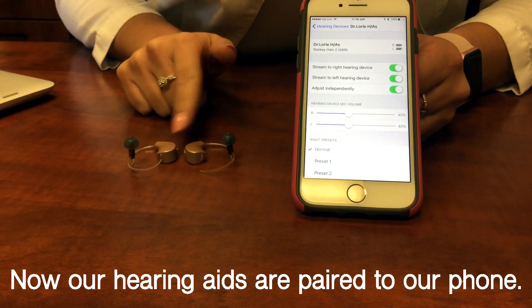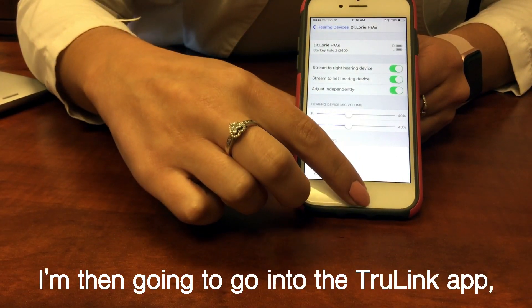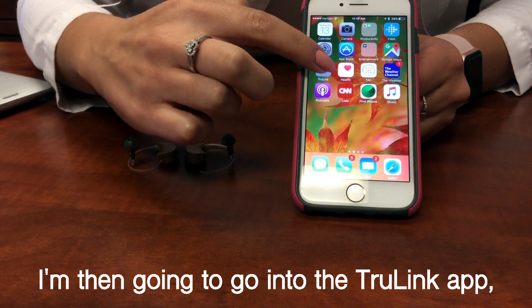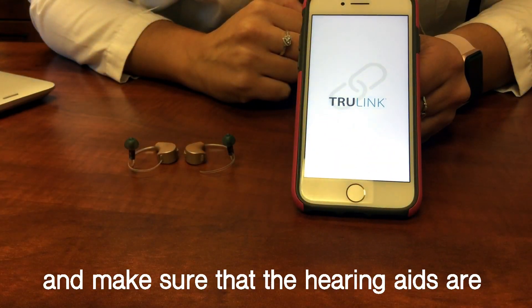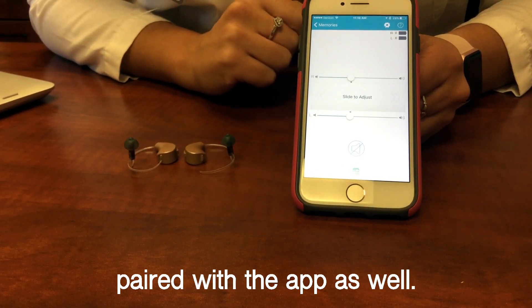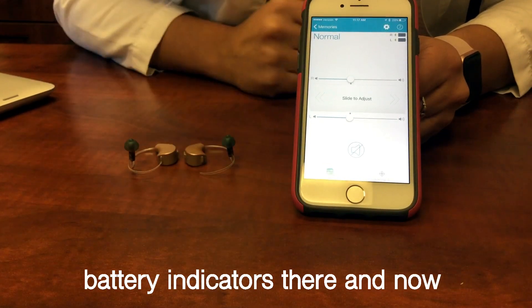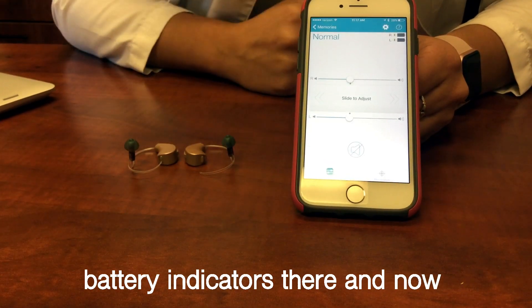Now our hearing aids are paired to our phone. I'm then going to go into the Truelink app and make sure that the hearing aids are paired with the app as well. We will see the right and left with their battery indicators there, and now we're good to go.